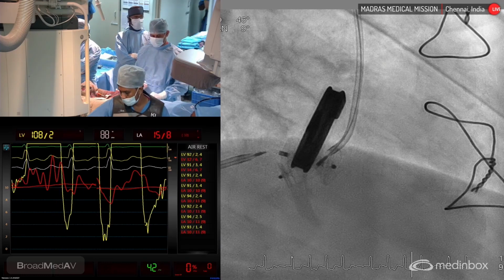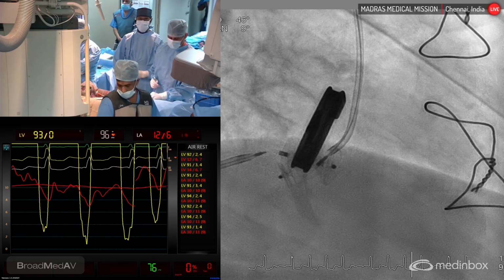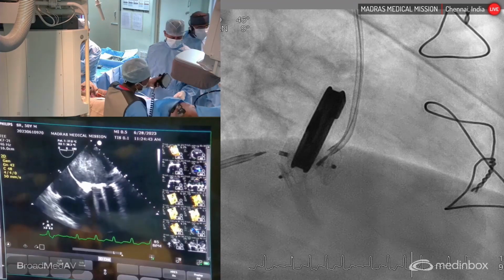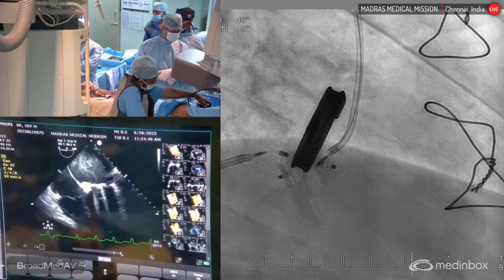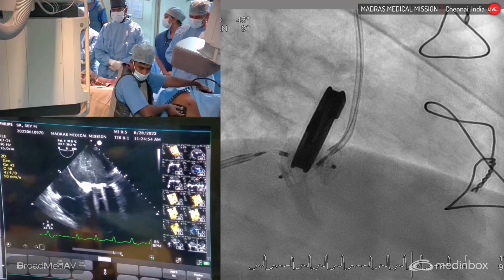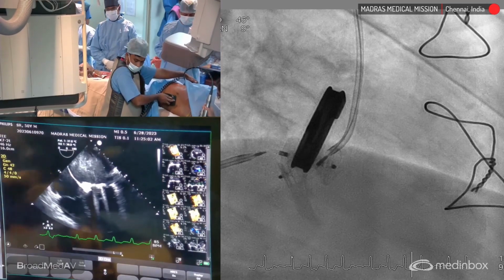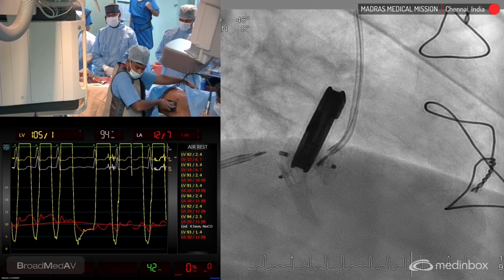Let's get an electrical cardioversion, 200 joules, single shock, synchronized, and give a broad vector, Prabhu. We can keep the sternal paddle beyond the right mammary region, and that one towards the apex. 200 joules. Okay, so supplement heparin. Okay, ready? 200 joules.